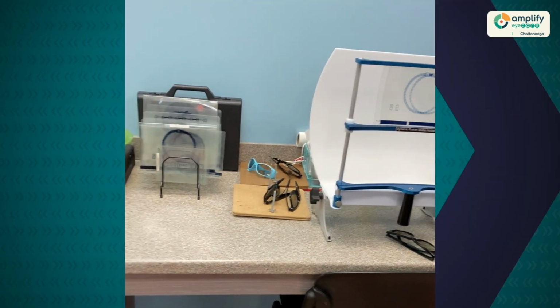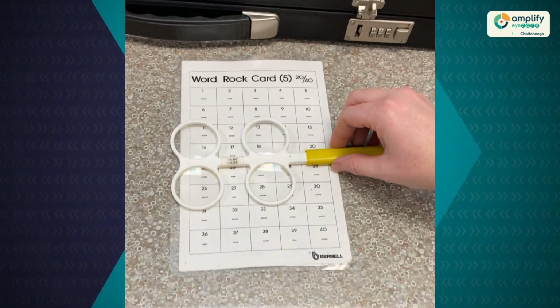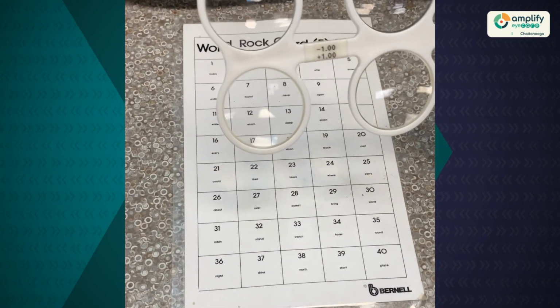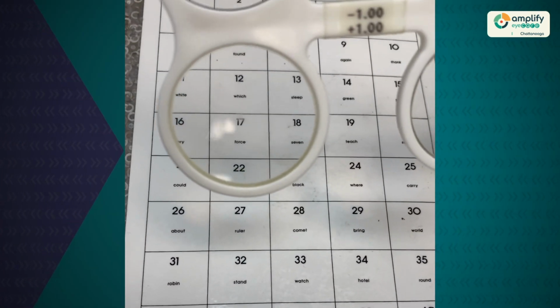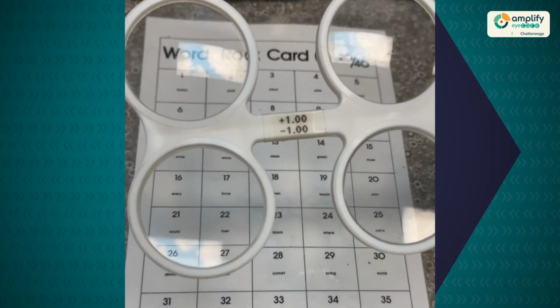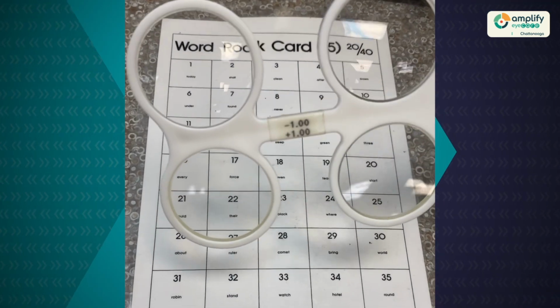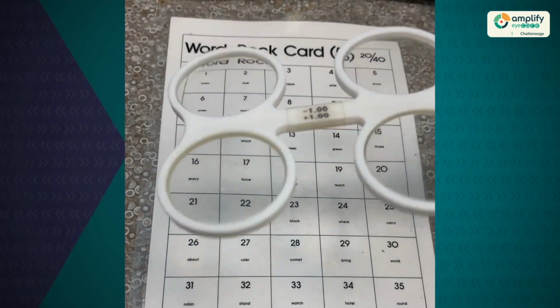One of the other common diagnoses we see is difficulty with accommodative or focusing system. So one of the common things we use here are plus or minus lenses, and plus or minus lenses will either magnify or minify the image. So in these cases, we have the patient going back and forth, and this is stimulating or relaxing the focusing muscle.